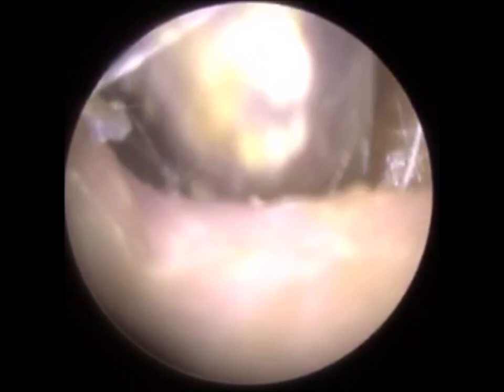So I've just gone in with the forceps. I managed to remove a piece there, but it kind of tore away. It didn't come out in a big piece, so I'm just going back in there. People often say, why don't you use forceps to remove it? But with this consistency, it just tears. It's quite damp and soft and elastic. If it was a solid, hard piece of keratin or wax, yes, you can get a grip and just pull it out. You can see how wet it is here.